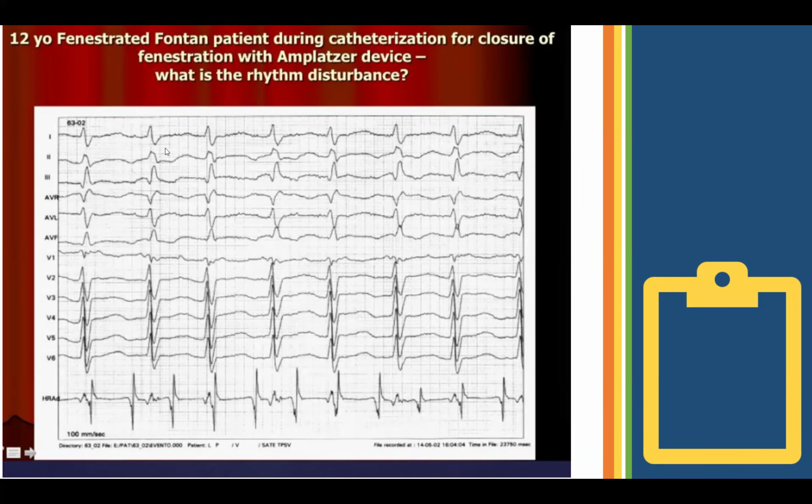And remember that even though the catheter is in the high right atrium, first of all, it's a Fontan patient, so it's hard to get atrial polarization. But usually when you're in the atrium, you can sometimes get far field ventricular electrogram. So if we look here when the QRSs are, you can actually see there is an electrogram on the high RA catheter, which seems to correspond with that. But then the atrial signal actually is larger, right? Much larger, and that makes sense because you're recording directly from inside the right atrium.